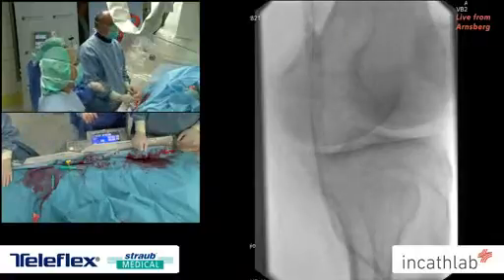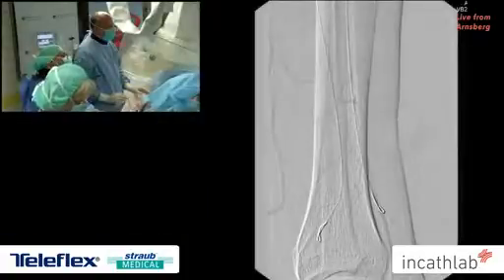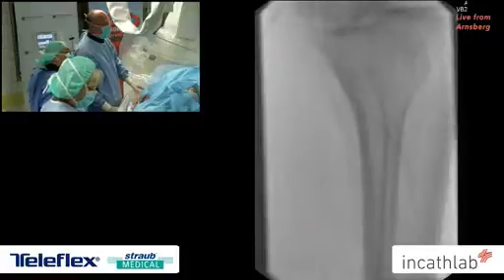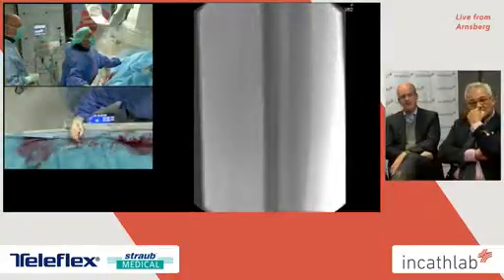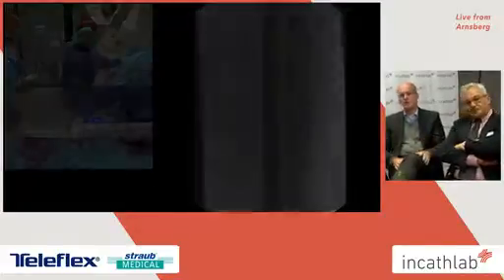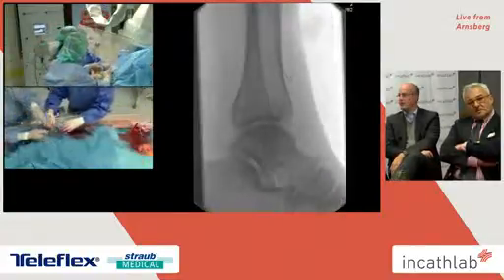But coming back to the support, maybe for the audience listening, do you recommend the longer balloons or the shorter length of the balloons for the support? If you use the GPS, I think the shorter ones give you more support. Yes, definitely, for sure. But you have the opportunity to use long balloons for just one inflation, and this makes it also very interesting for long CTOs. So you said this is a 4F system?